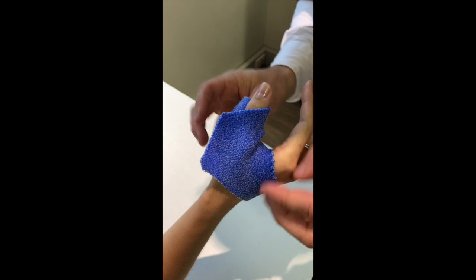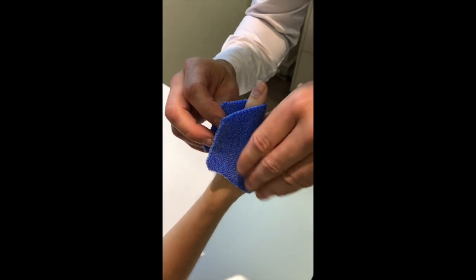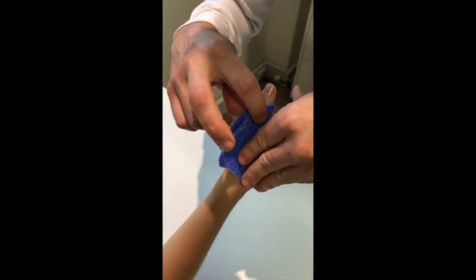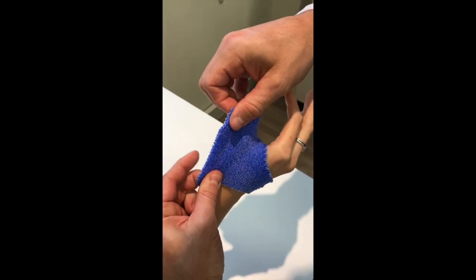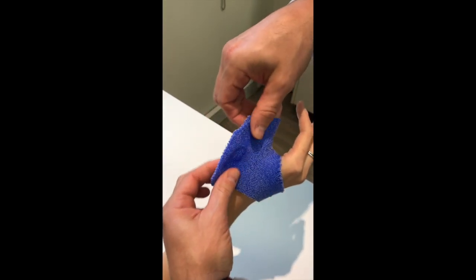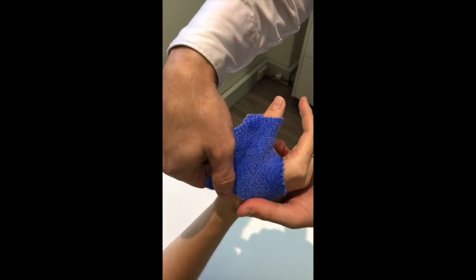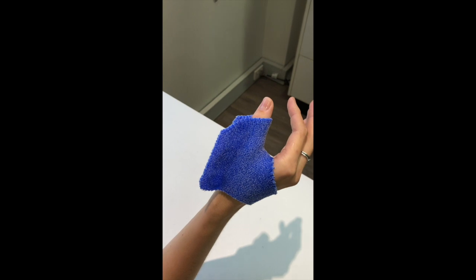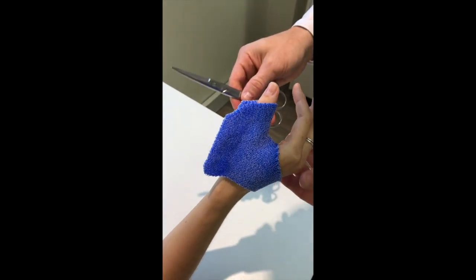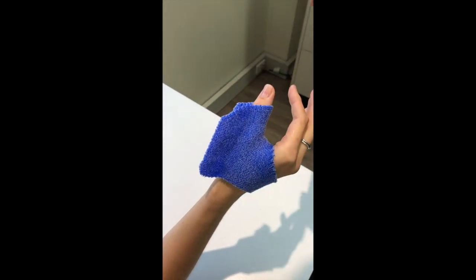So we pinch it on the ulnar side. We can forget about that piece now and pay attention to our dorsal component, which is the most important part. That's where the person is going to be getting the support for their thumb. So we're pinching it on the dorsal aspect and then using curved scissors to cut that section.